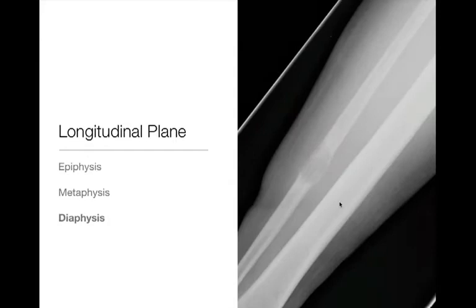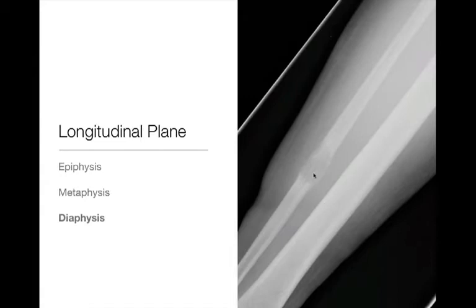Next up is the diaphysis. This is an example of a diaphyseal lesion: a geographic lytic lesion with a wide zone of transition and periosteal reaction, centered in the diaphysis of the fibula. Because of the wide zone of transition and periosteal reaction, we start worrying about more aggressive processes — and this was a metastatic lesion in this case.